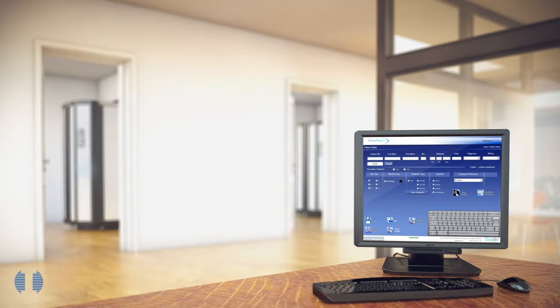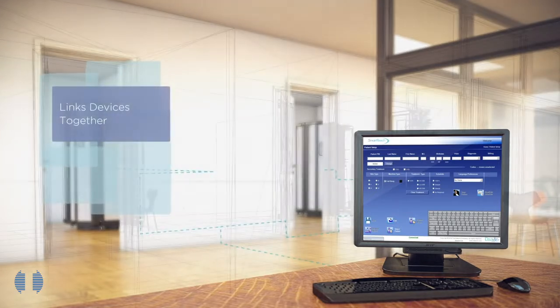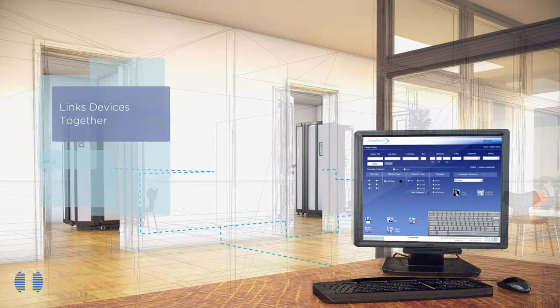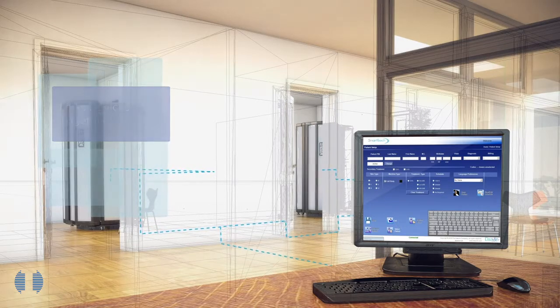Smart Touch also makes it easy to link together a group of devices, keeping all patient records in a centralized database and greatly simplifying scheduling.